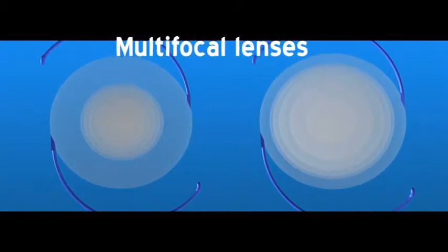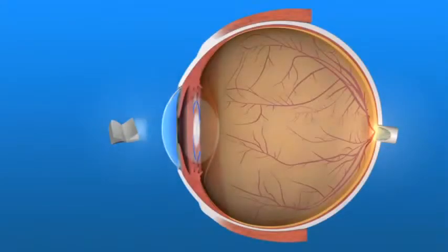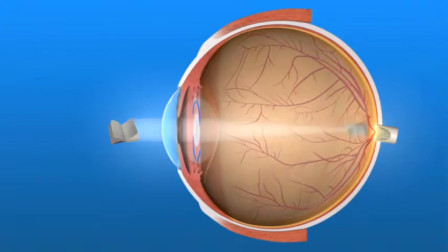These lenses are called multifocal and accommodating IOLs. They provide the option of seeing well at more than one distance when you're not wearing eyeglasses or contacts. Multifocal lenses use specially designed circular focal zones or rings on the surface of the lens. Depending on where the light rays are focused through the different zones or rings, you may be able to focus well at both near and distance.